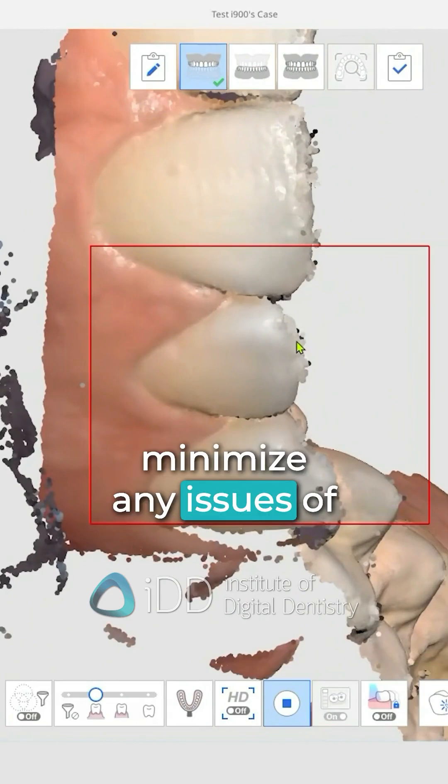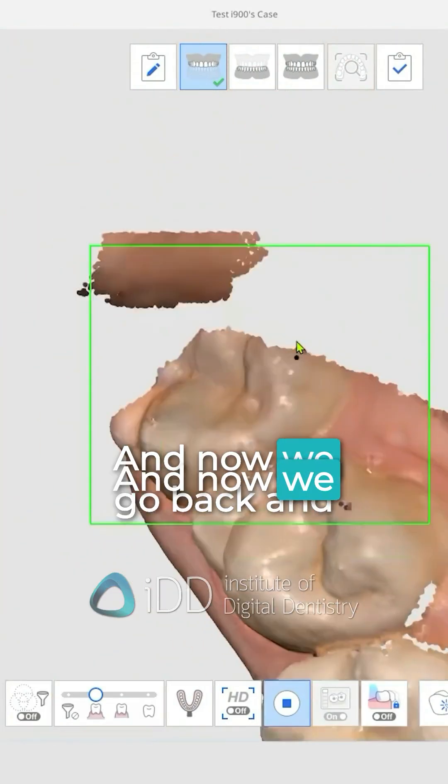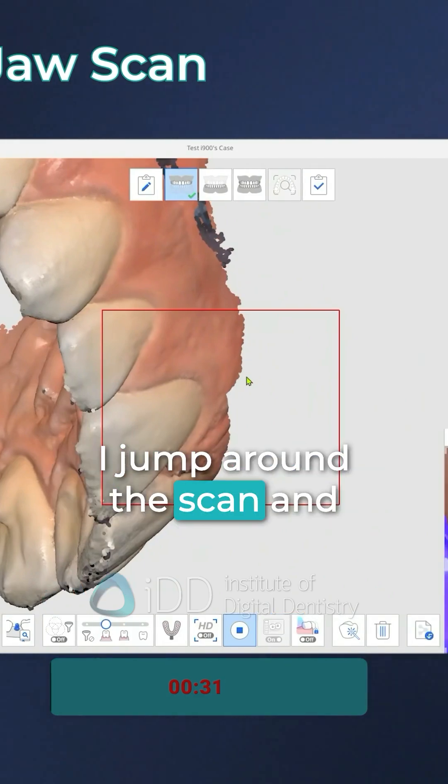To minimize any issues of overlapping edges, we finish the scan and then go back to fill in all the little holes. This is typically in the embrasure points — I jump around the scan and fill in all the areas where I can see there's missing data.